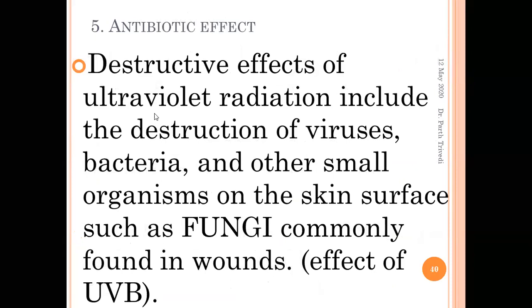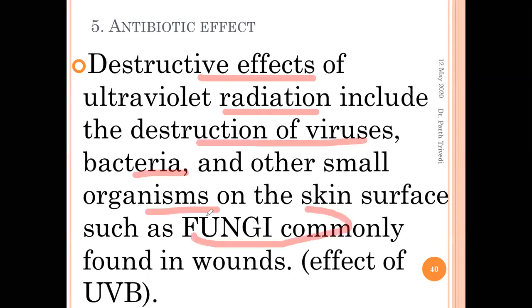And then the fifth effect is the antibiotic effect over that area. That is nothing but the destructive effect of ultraviolet: it increases destruction of viruses, bacteria, and other small organisms like fungi in open wounds. Yes, that is generally the effect of UVB.